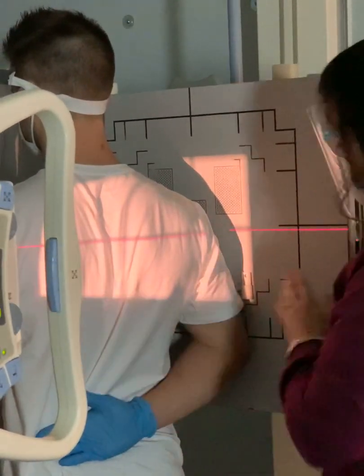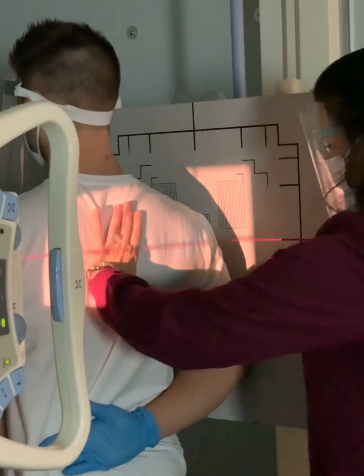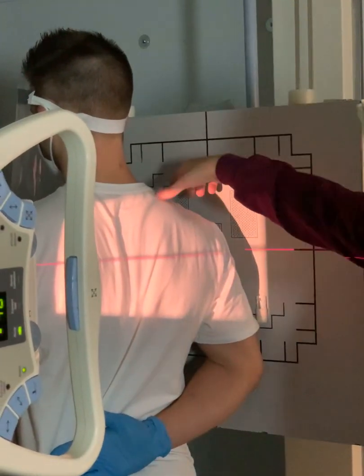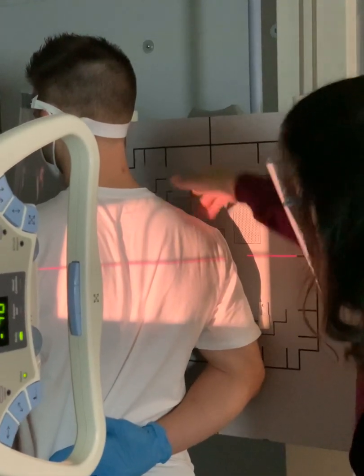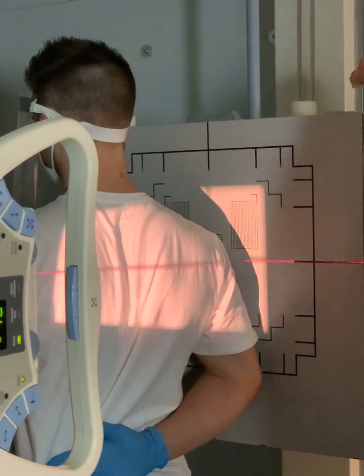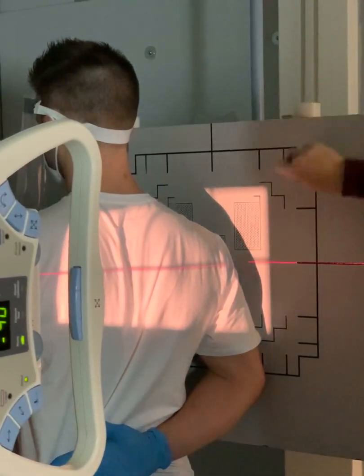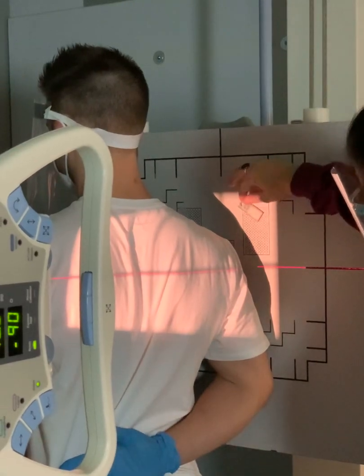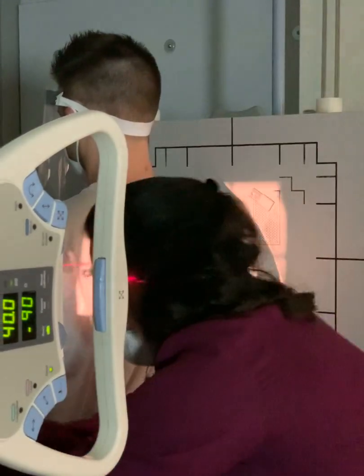Just a little bit more. Central ray is coming in, medial border. I've got superior angle and AC joint perpendicular to the IR. I'm going to put my right marker. This is his right arm. Just like that. I'm going to shield my patient.